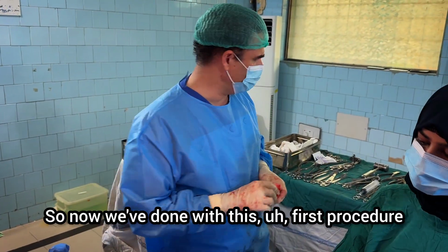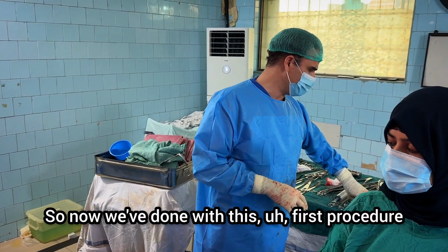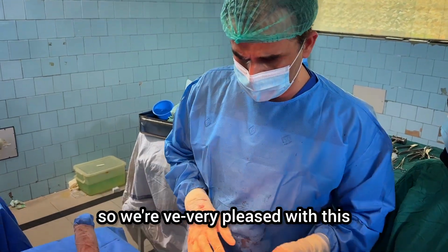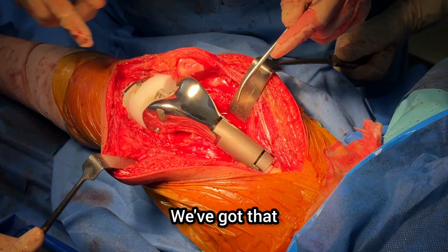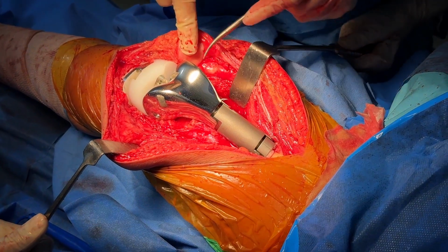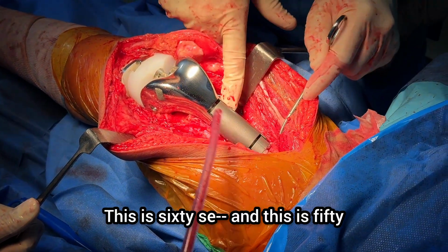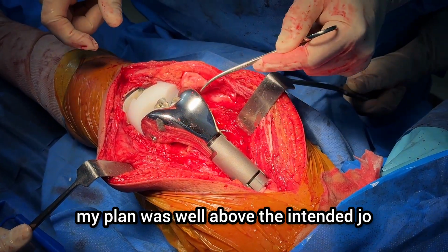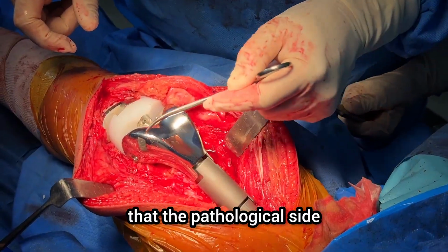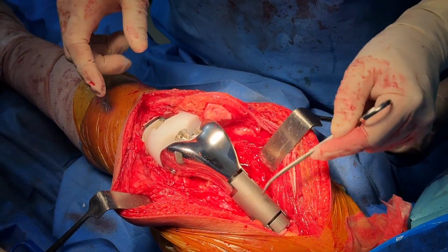So now we're done with this first procedure. We're very pleased with this. You can see here, standard, we get the size from the femur. We've got that. That's 70 millimeter, right, Chand? This is 60 and this is 50. Total 110. My plan was well above the intended, where the pathological site and the fractures were. So we've gone right above there.